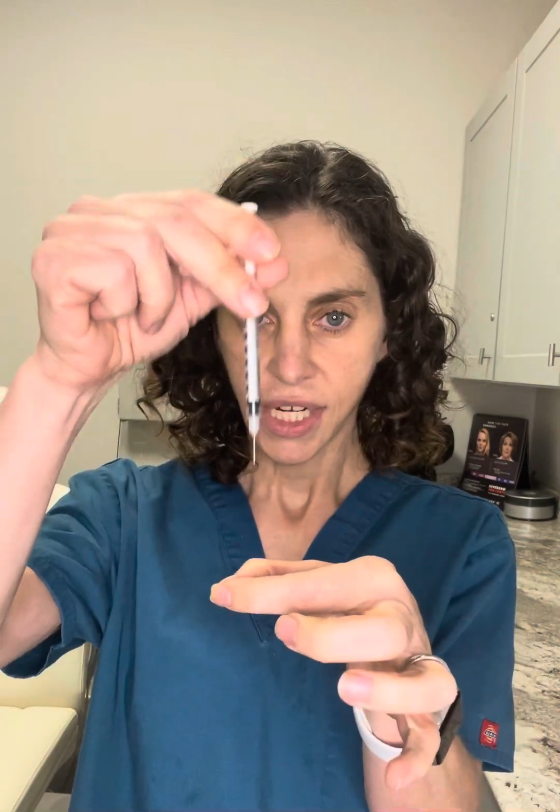Then you find an area, arm, belly, inner thigh, pinch just the fat, go in at a 90-degree angle, push the plunger in, release, you're done. Then you put your sharp, the needle, in the sharps box.